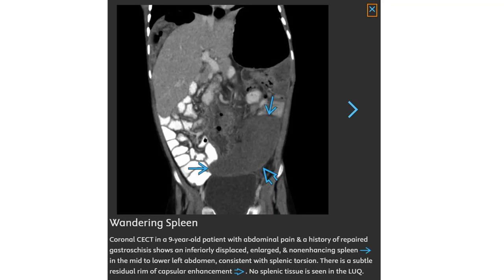This is a contrast-enhanced CT in a nine-year-old patient with abdominal pain and a history of prior sickle cell crisis. There is an inferiorly displaced, enlarged, and non-enhancing spleen in the mid to lower left abdomen, consistent with splenic torsion. A subtle residual ring of capsular enhancement is present. No splenic tissue is seen in the left upper quadrant.